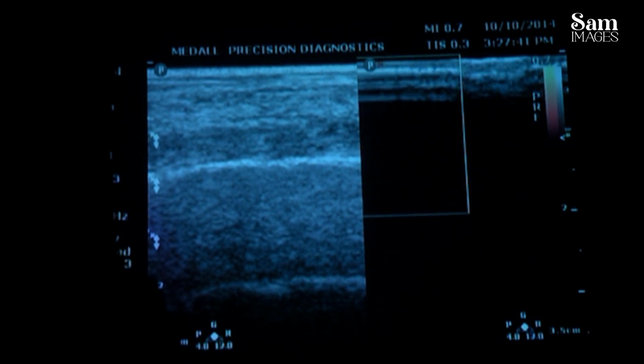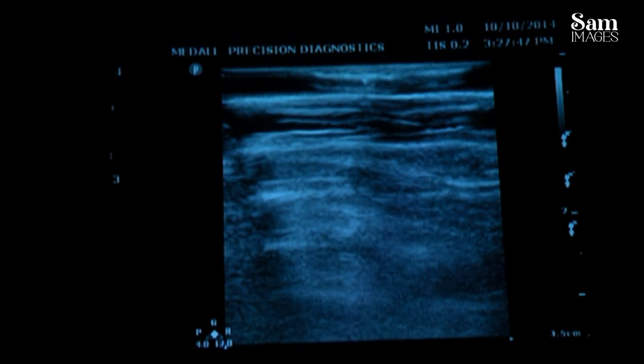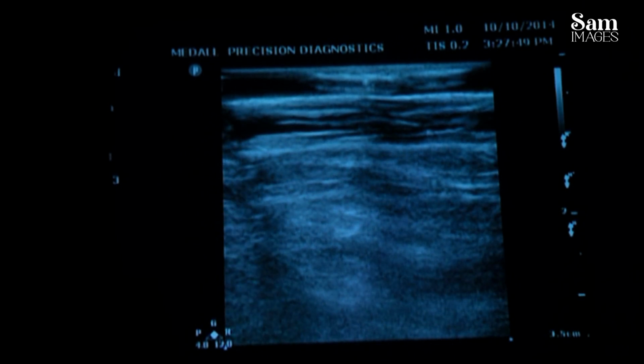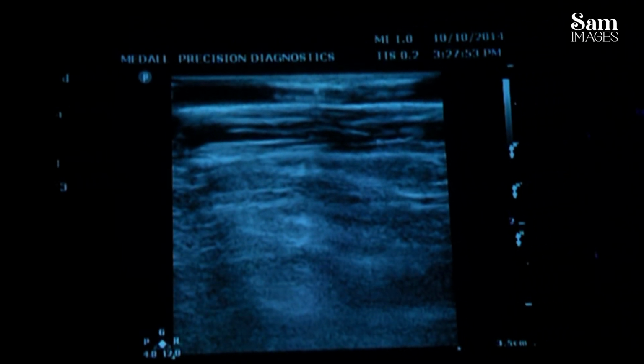Now I'm just going to look for the lymph node. Beautifully Dr. Rajiv has shown you the stations. What I'm going to show you, camera on.